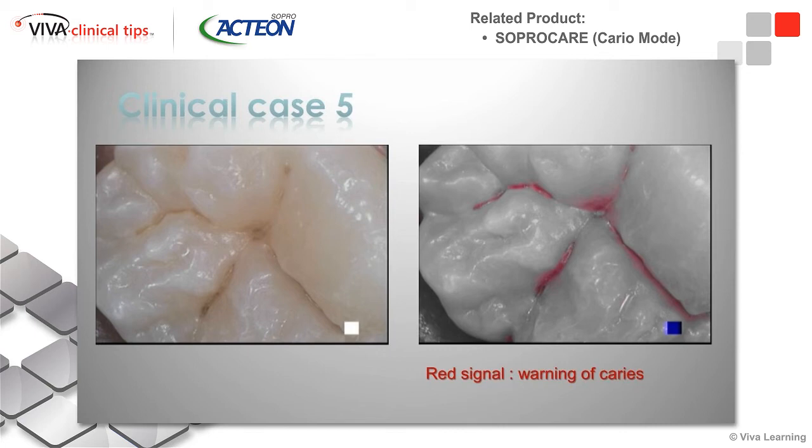So I've seen some amazing things. I'll tell you, yesterday or the day before, I had a patient, and it was unbelievable, but he had been in ortho for, it must have been 4 years, and the mom didn't want x-rays after he got out of his braces. So, there was no talking her into it, so I proceeded, and I thought, you know what, at least I have my camera, and I could put it on the caries mode. And lo and behold, very much like what we have presented here, that's why it reminded me of it, out of each quadrant, 2 molars and 1 premolar. In all 4 quadrants, either needed a sealant or an occlusal composite.